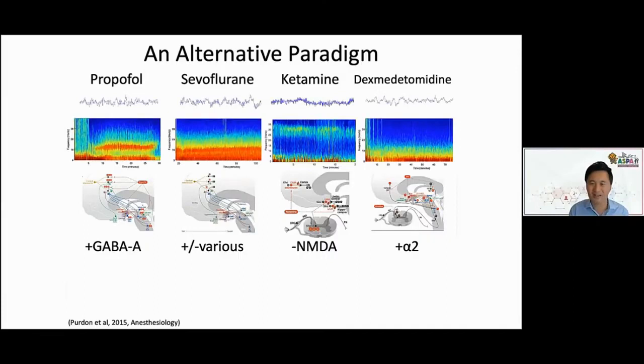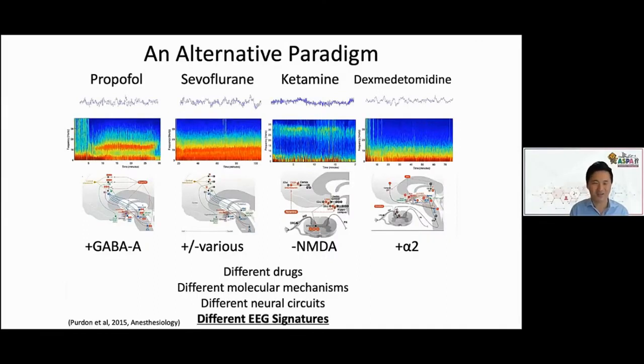There's a corresponding EEG pattern to each underlying mechanism, and we can read that out in the EEG and use that to better understand what a number might be telling us, right? I'm not really necessarily criticizing the number. It can be useful, especially for tracking trends and changes, but it's very helpful to understand the underlying waveforms and the spectrogram patterns so that you can be sure of what you're seeing.